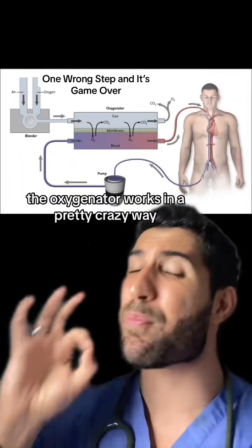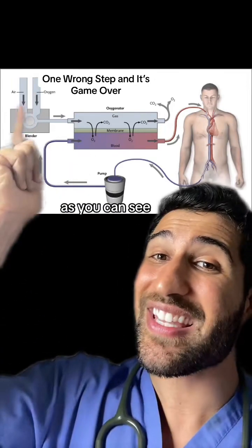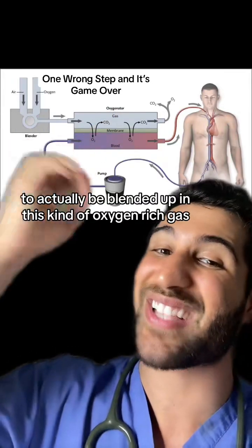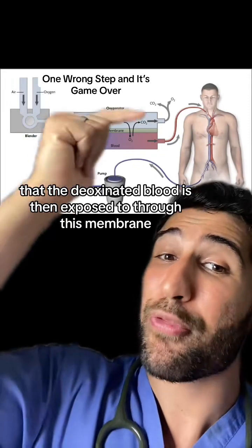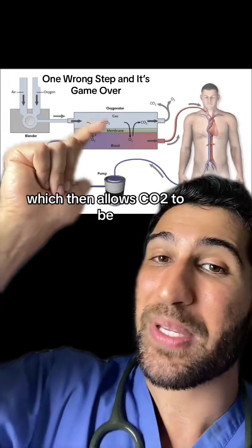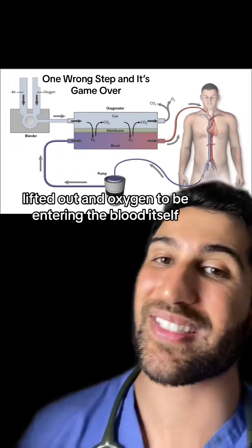The oxygenator works in a pretty crazy way that tries to mimic the function of the lung. As you can see, the air and oxygen both come through here to be blended into an oxygen-rich gas that the deoxygenated blood is then exposed to through this membrane, which allows CO2 to be lifted out and oxygen to enter the blood itself.